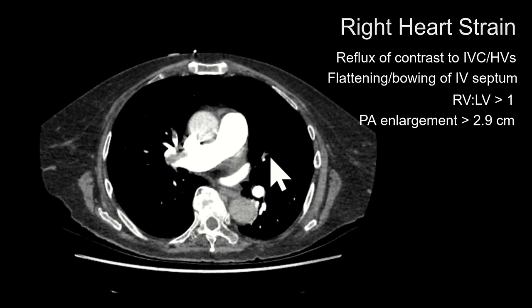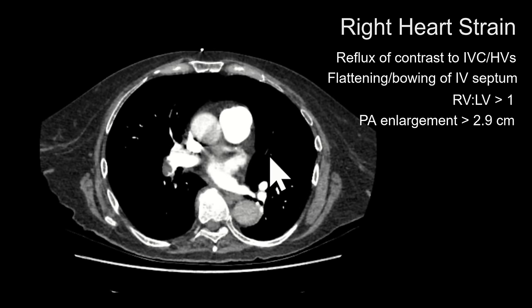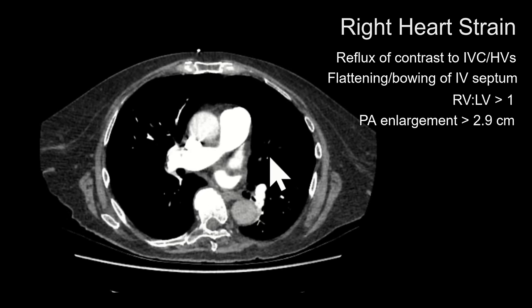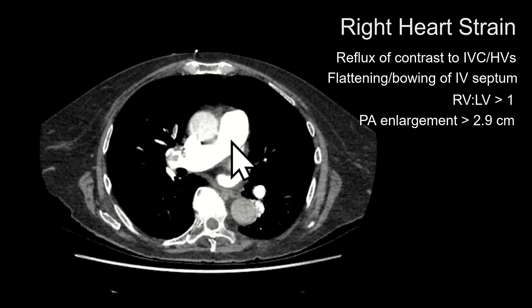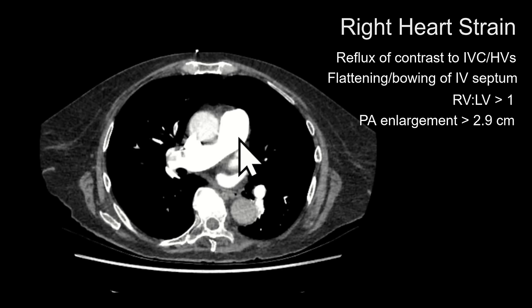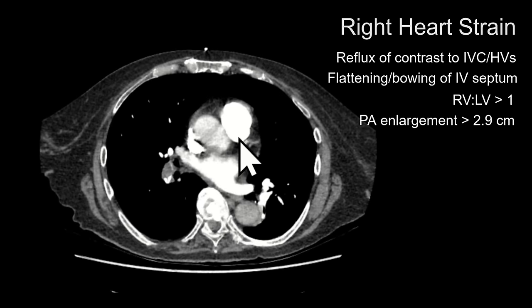You should be looking for these things in every case of PE. Some findings can be seen chronically — for example, enlargement of the PA over 2.9 to 3 centimeters alone indicates pulmonary hypertension — but if these are present in the clinical setting of significant PE they would be suggestive of acute right heart strain.